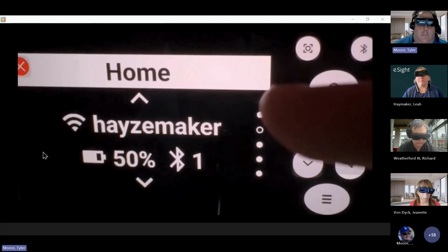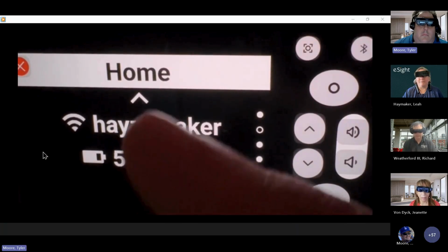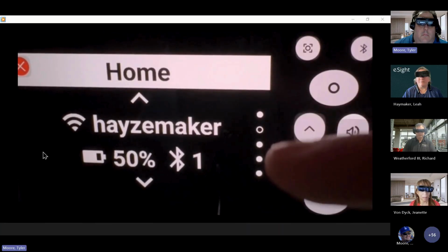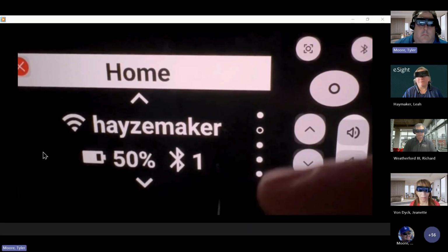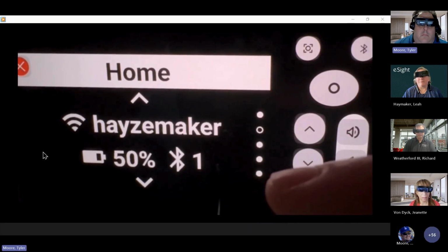Otherwise, it would only have 4 dots on the right-hand side, and there would be no up arrow like there is now. So that's the only difference between this screen and what you would see if you're not connected to eShare. So in regards to these 4 dots, or 5 dots here, but originally 4, that tells you how many pages are in this particular column.